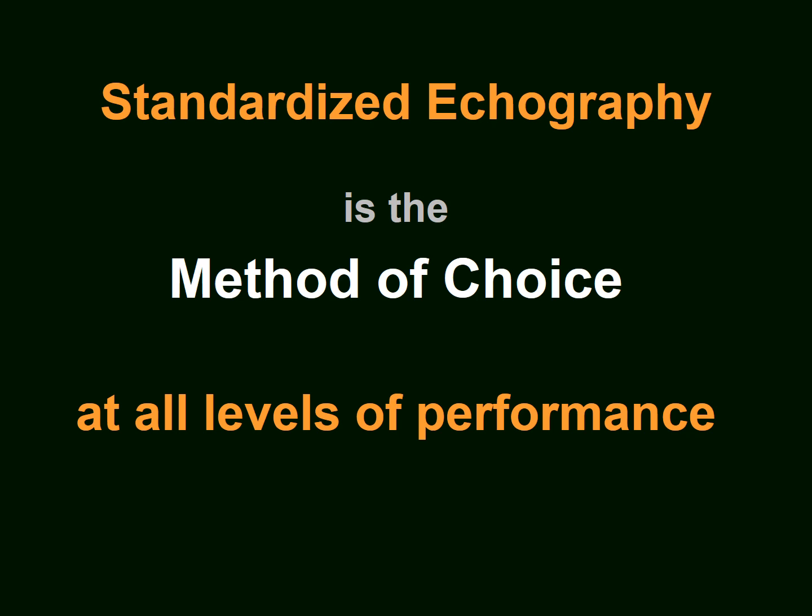When it comes to measurement of extraocular muscles and to grading of Graves' orbitopathy, the method of choice is standardized echography. When it comes to tissue differentiation, to the diagnosis and differential diagnosis of a malignant melanoma, for instance, or a metastatic carcinoma of the choroid, all these tasks are done with standardized echography as the method of choice.